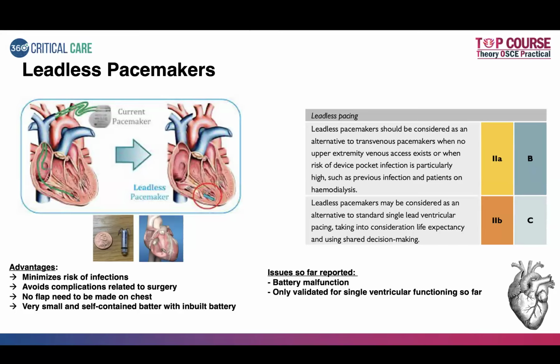So the ESC guidelines in relation to pacing had shown that leadless pacemakers should be considered as an alternative to transvenous pacemakers when no upper extremity venous access exists, or when the risk of device pocket infections is particularly high, such as previous infections and patients on hemodialysis. So these should be considered for the indications for leadless pacing.